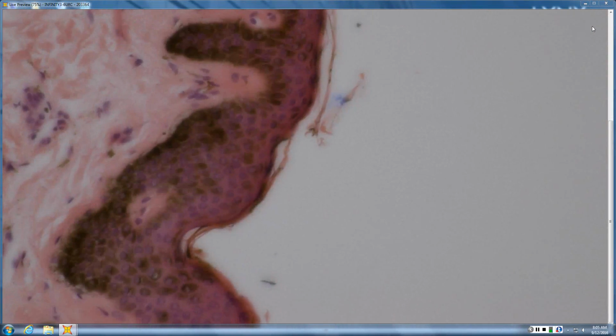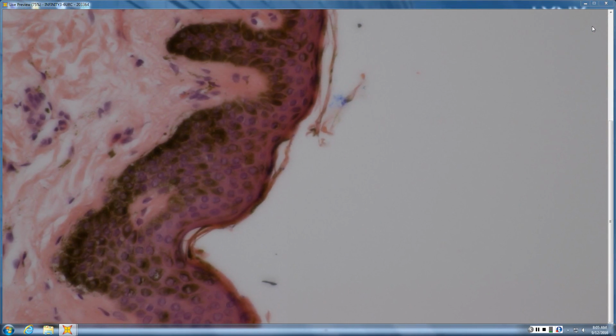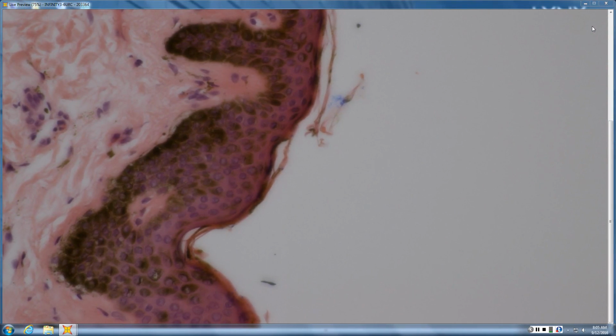It's fairly sharply circumscribed. Is the pigment confined to the basal layer? No, it's not. In fact, there's a lot of pigment in the corneum. Anything with pigment in the corneum looks black clinically. This would have been probably a red-headed individual with freckles on their shoulder, and then one freckle-like thing that you can almost see through, but it's jet black and irregular. They're called ink spot lentigo. Ink spot lentigines tend to be in redheads on the shoulder, jet black but almost see-through, so you get the sense it's a thin lesion.